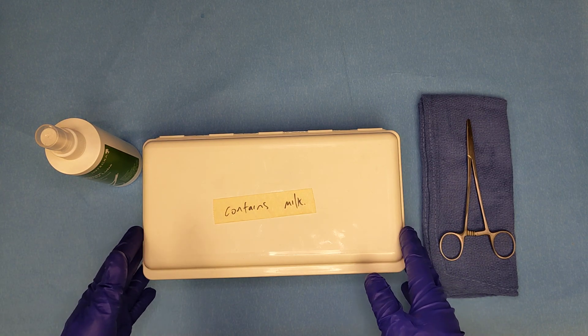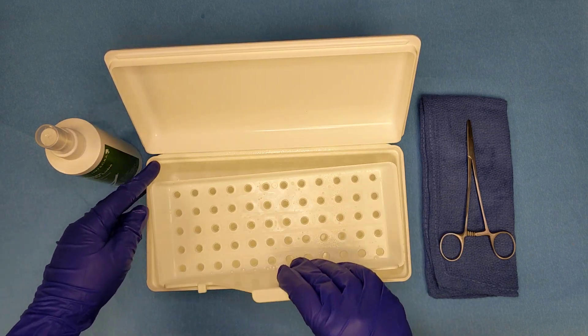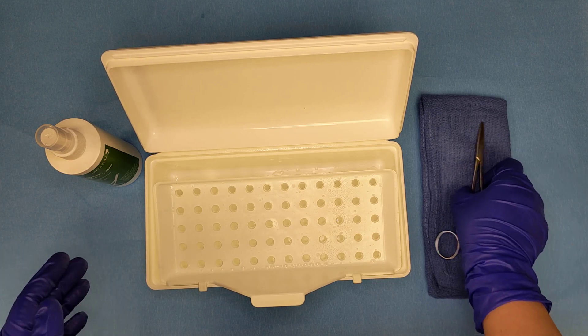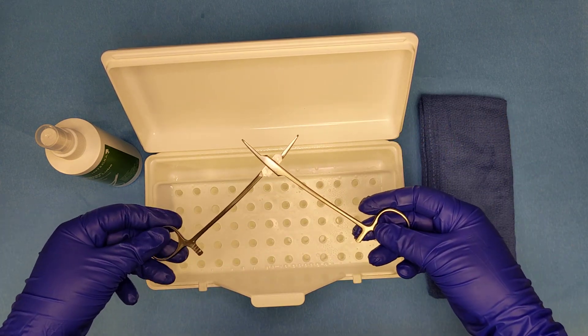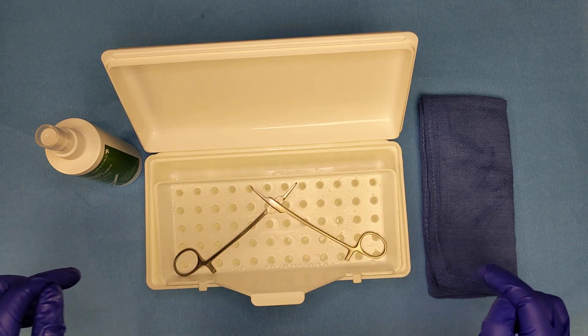The first step to lubricating an instrument is setting up our lubrication container. We're going to open up the box and there's a little tray in here that sits on the edge, so we're going to hook it on the edge there. Then we're going to open up our instrument and set it inside of the tray, exposing the parts that we want to lubricate.